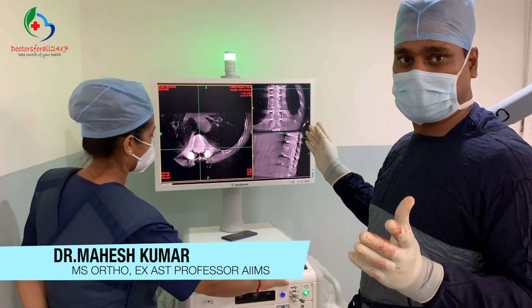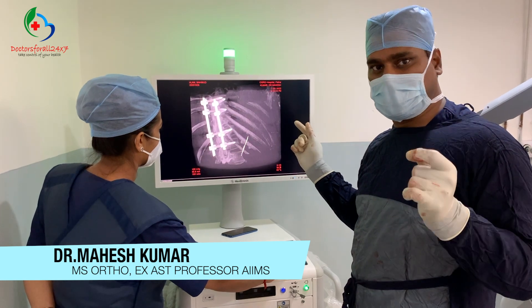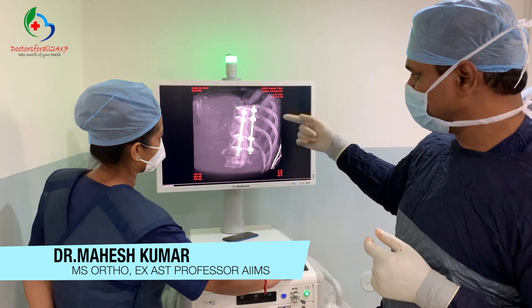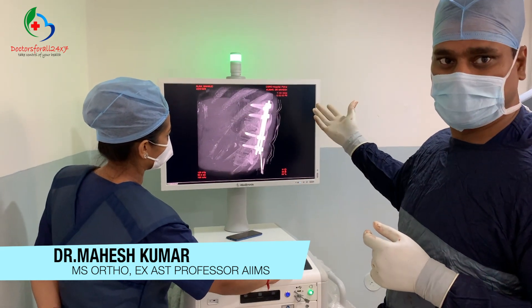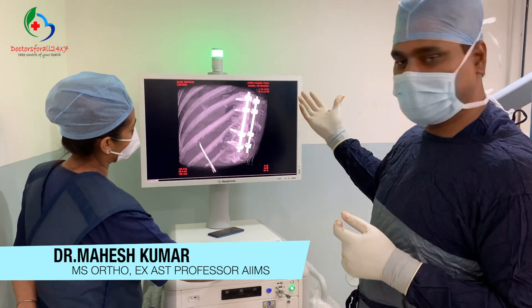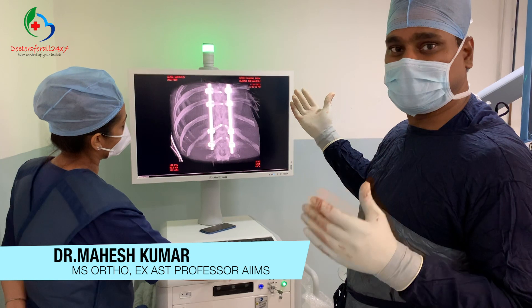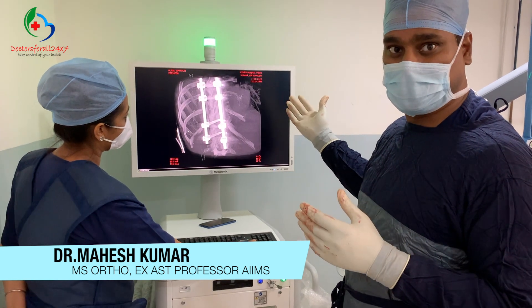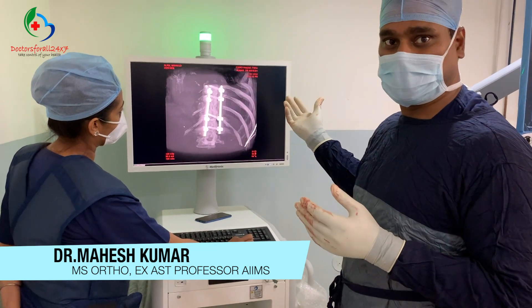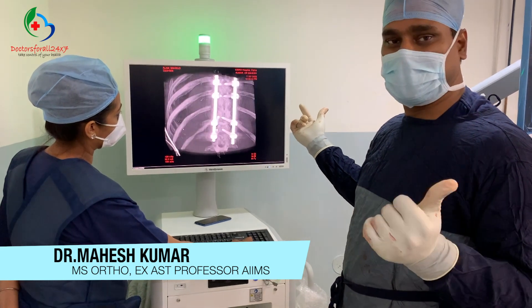You don't have to take the patient outside the operating theater for confirmation of whether the surgery has been done well or whether the implant has been placed accurately. This is the three-dimensional view of the same, and you can see it has been perfectly placed. This gives the accuracy of surgery — a sense of perfection, completeness, and comfort for both surgeon and patient that nothing is wrong. This is why O-Arm with system navigation is such a beautiful technology, and it is truly a boon for patients undergoing spine and complex procedures.